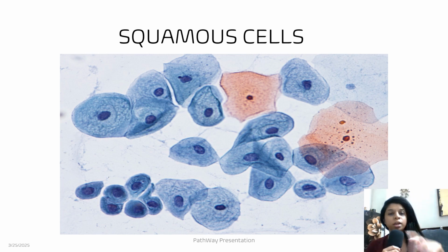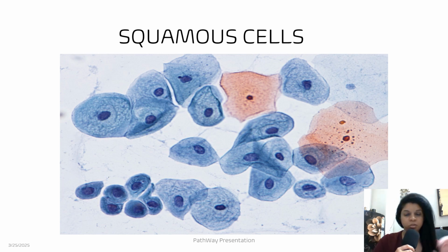So you can get stages which are almost superficial to intermediate, or intermediate to parabasal, or parabasal to basal. So it's according to your discretion and experience that you can count it as intermediate or parabasal or superficial. Okay. With experience, you will understand where to classify. But for the time being, if they are not atypical, you can put them in a category which is nearby.